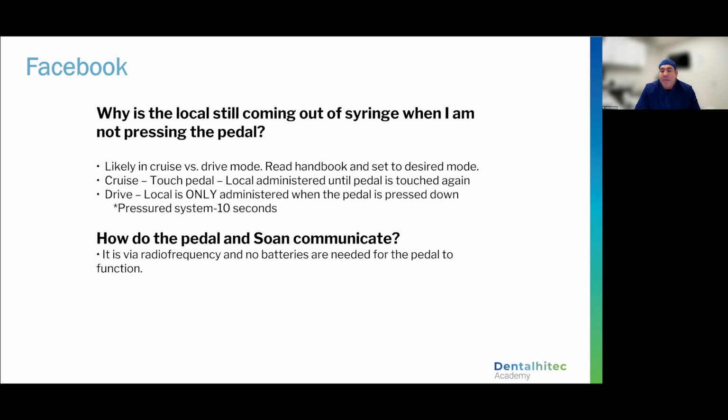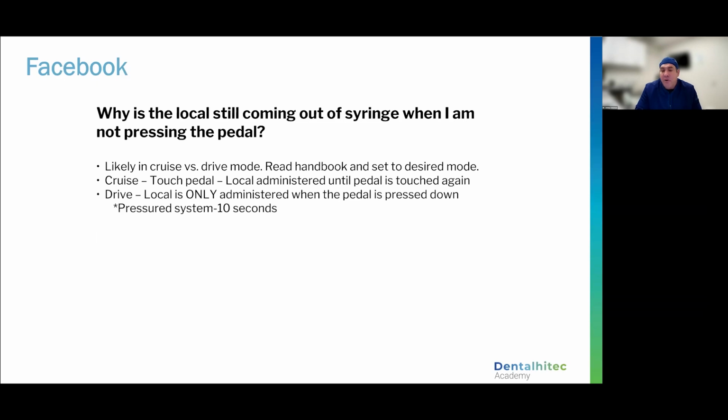Okay. A couple of you have asked, is there a battery inside the foot unit? There is not. It creates its own power, but without going into detail, it sends a radio wave to your unit. So you don't have to worry about replacing batteries.